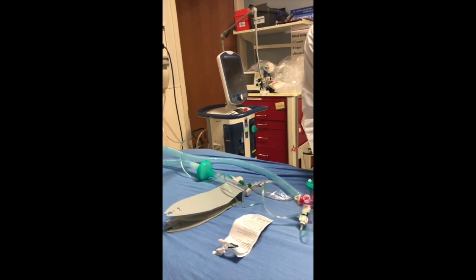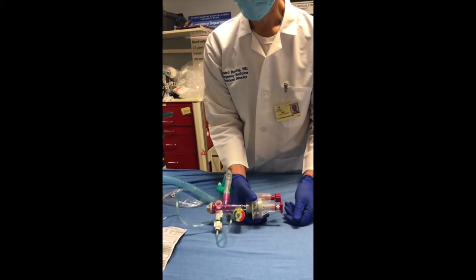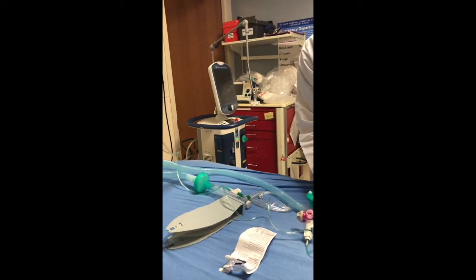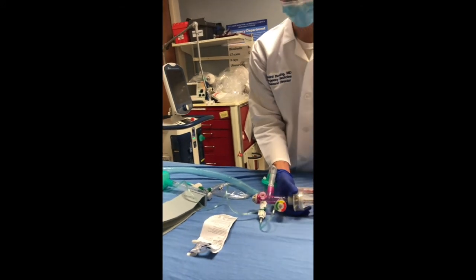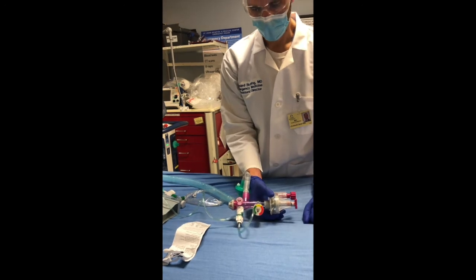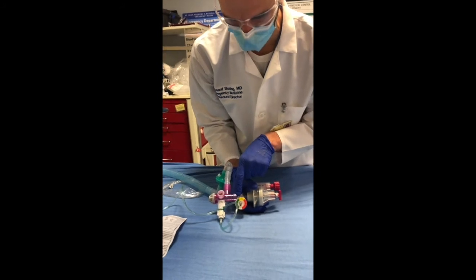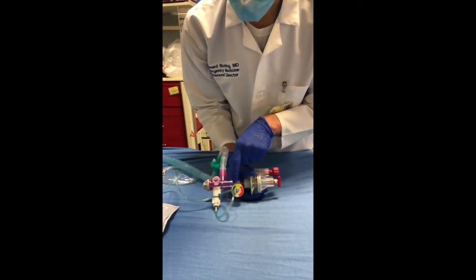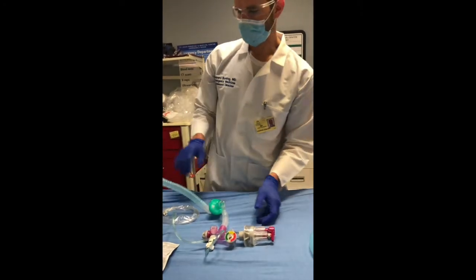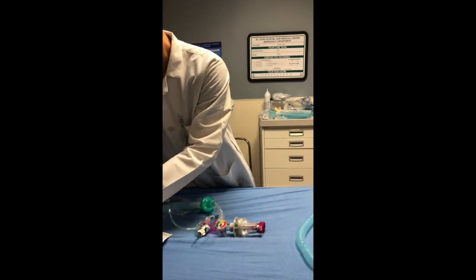If I want to decrease the tidal volume, I'm going to decrease the pressure by unscrewing, and now the patient is getting much smaller breaths delivered. And if I want to get a larger breath delivered, I'm going to tighten this screw, which will deliver larger breaths. You can see how much pressure is actually being delivered to the patient in centimeters of water. That's the standard setup for one patient.